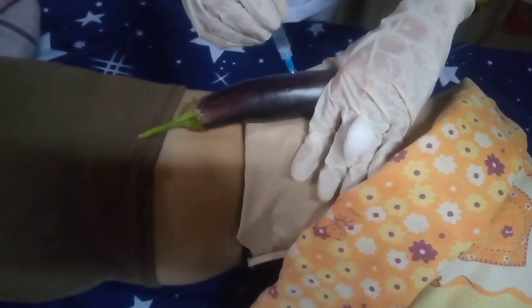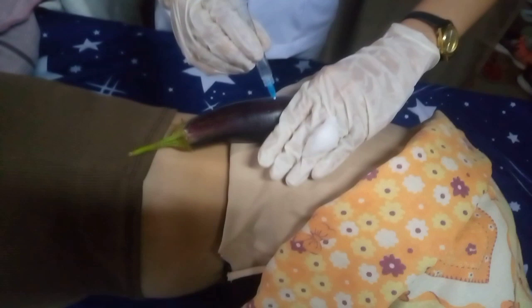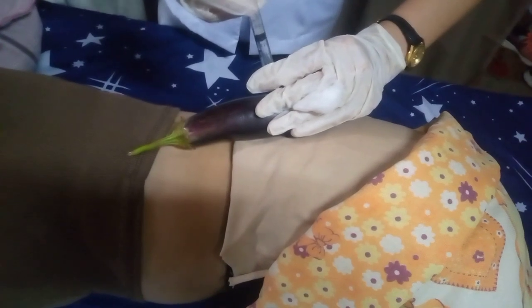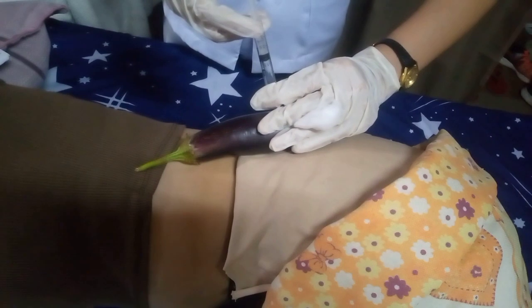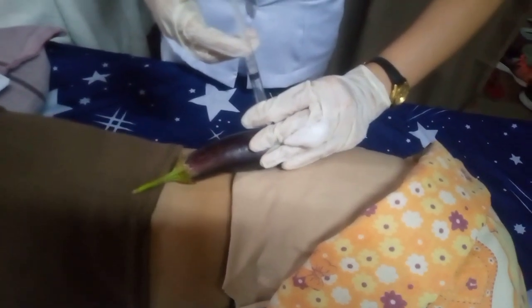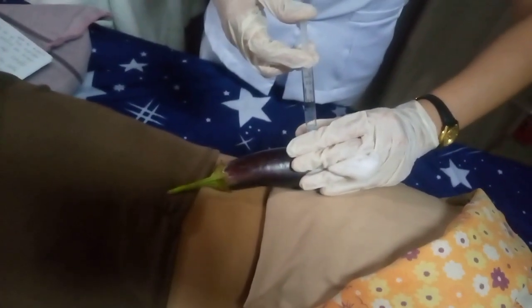Aspirate the syringe by pulling back the plunger with your dominant hand. This is to determine if you hit a blood vessel. If blood appears, it means that you have hit a blood vessel, so remove and discard the needle and syringe and start over. Otherwise, inject the medication slowly, at the rate of 1 ml per 10 seconds, wait 10 seconds, and withdraw the needle.